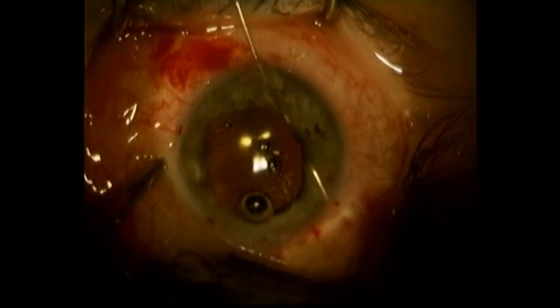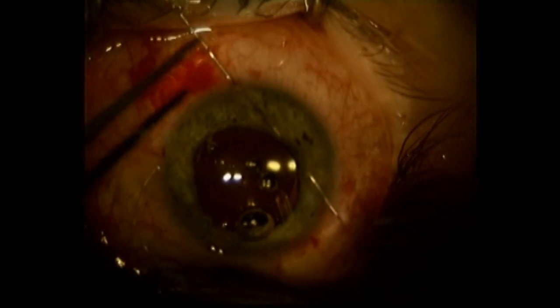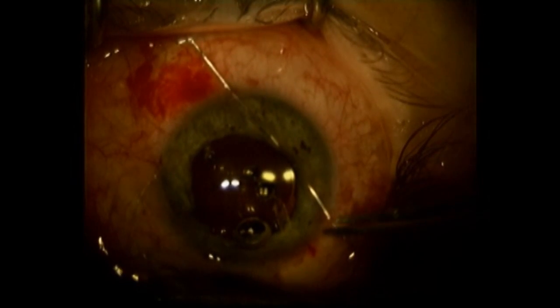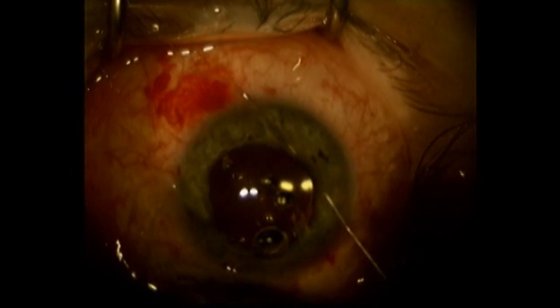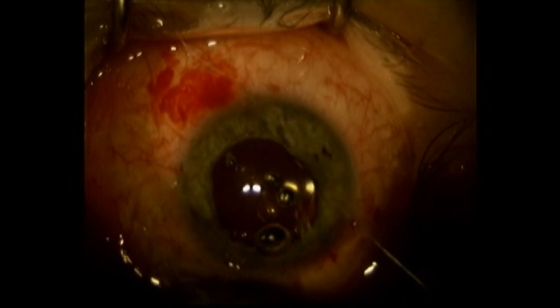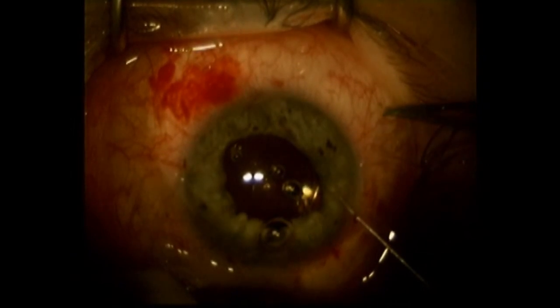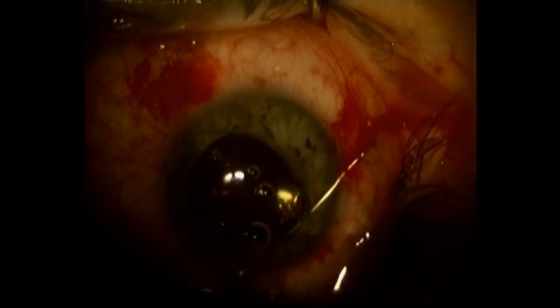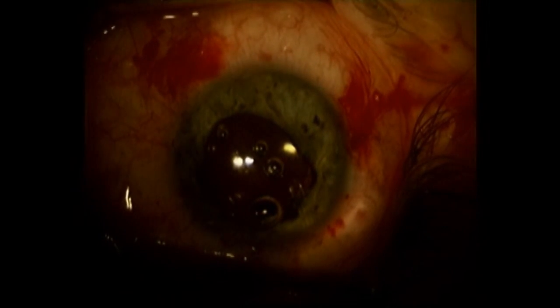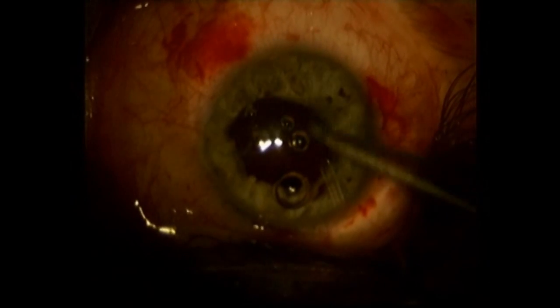You've got to assess these patients prior to surgery. Make sure they don't have too much atrophy. If this has been a long-standing process, it's easy to pass the needle through tissue that's almost like wet tissue paper, and long-term, even if it works initially, it can tear. So you can see this iris, despite being pale with a bluish-greenish color, still has adequate integrity to allow this 360-degree purse-string suture.